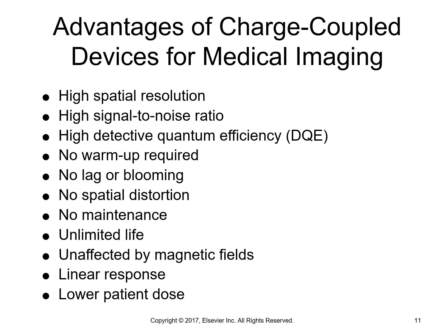Detective quantum efficiency is how good is my image receptor at catching photons. In the case of CCD, it's light photons. But when we think about it as far as digital X-ray technology, typically detective quantum efficiency is how good at catching the remnant signal this image receptor technology is. And it's usually expressed as a percentage.